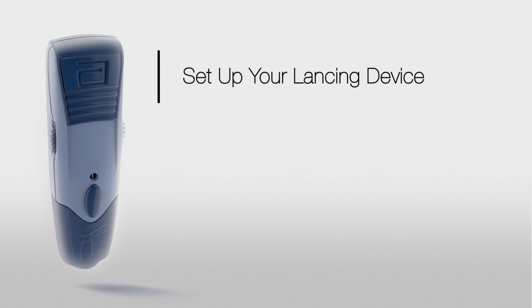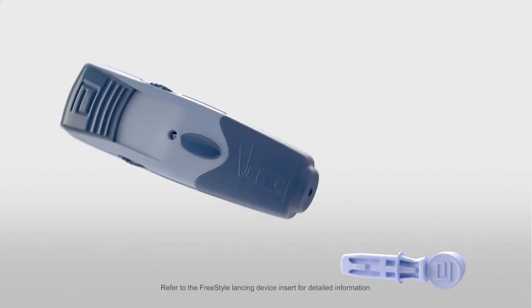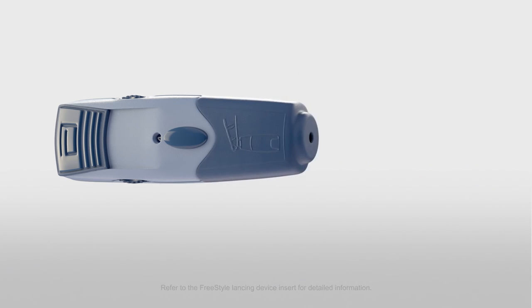Next, let's set up your lancing device. To use a new lancing device, just snap off the cap and insert the lancet into the holder cup on the lancing device. Twist off the rounded top and replace the cap.